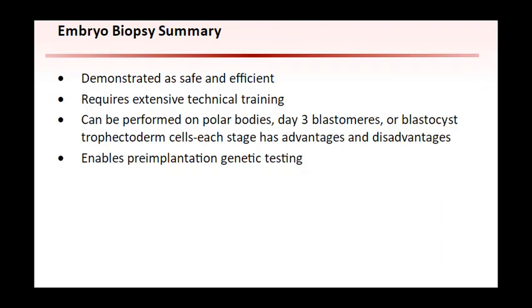In summary, biopsy has been shown to be a safe and efficient technique to be able to sample material from the oocyte or embryo. Zona pellucida breaching via acidified medium or the laser appears to have similar success rates. Biopsy is a skill that requires good eye-hand coordination, as do other micromanipulation techniques. Whether biopsy occurs at the polar body stage, cleavage stage, or the blastocyst stage depends upon several advantages and disadvantages that should be evaluated. The biopsied sample is then sent to a genetics reference laboratory to undergo pre-implantation genetic testing.